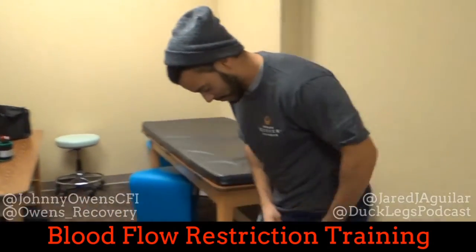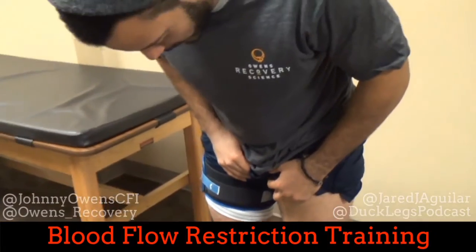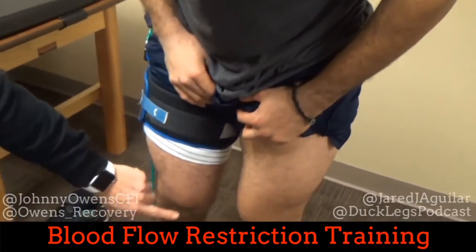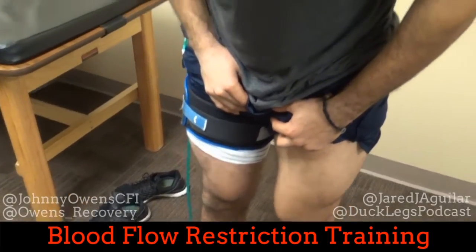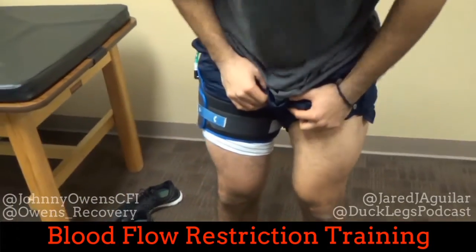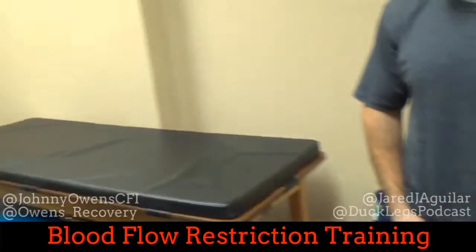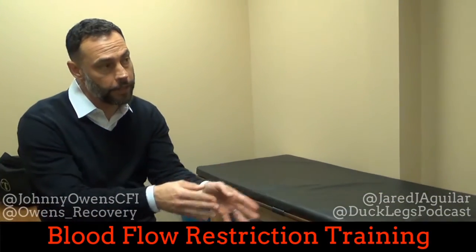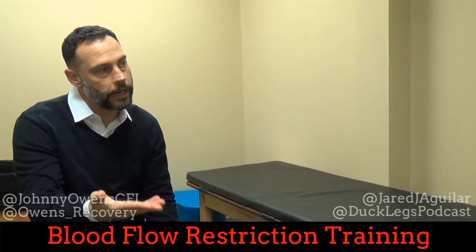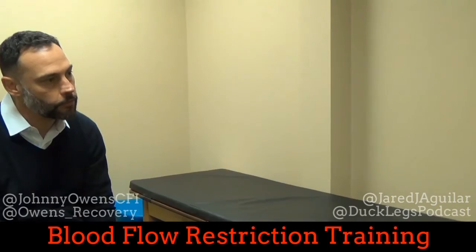Pull your legs up and you'll start to see one side is definitely starting to swell. We see swelling even in the VMO. That swelling effect makes the myocytes start to swell, and when the myocyte swells, that turns on protein synthesis. So even causing that swelling in the VMO, we're making the myocytes within those muscle fibers turn on protein synthesis to put on some size.